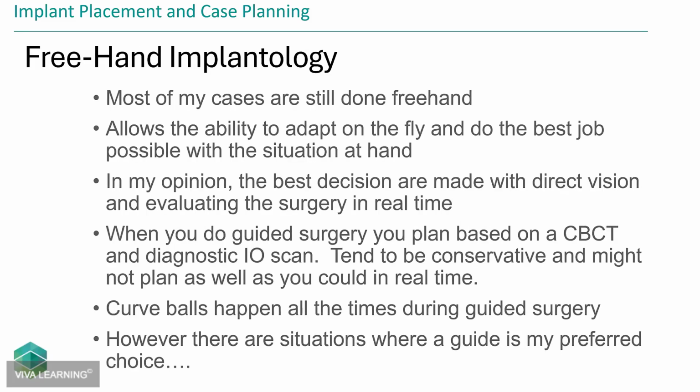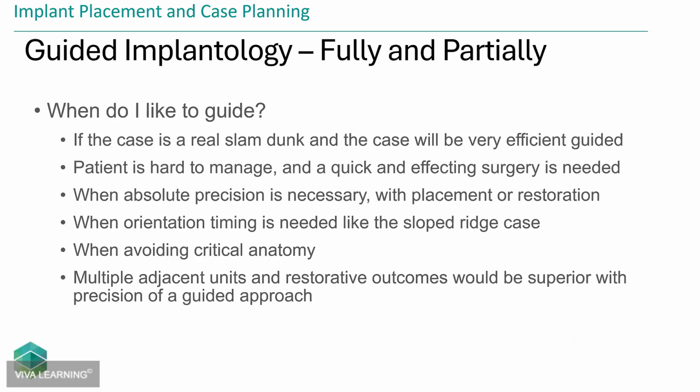A lot of the cases that I do free-handed are based on different parameters other than it just being easy. However, I do have my little guide over doing guided cases. If it's a super slam dunk, however, and I know I can do it better guided, then yes, I'll do that. Or if there's a patient that, I've had patients that can't even sit in a chair for more than 45 minutes. I'm going to guide those cases.